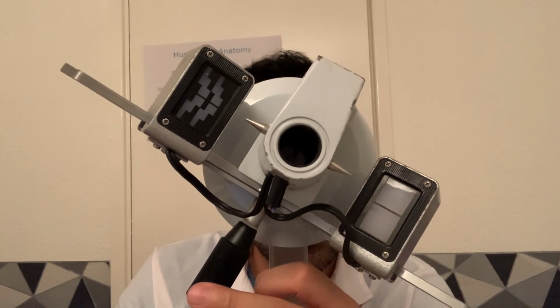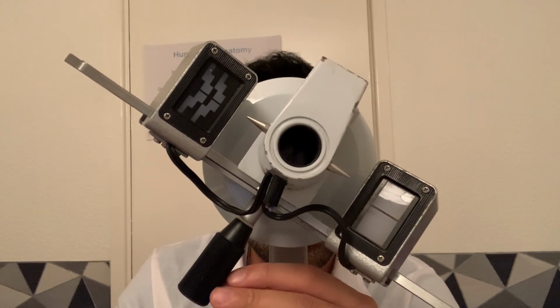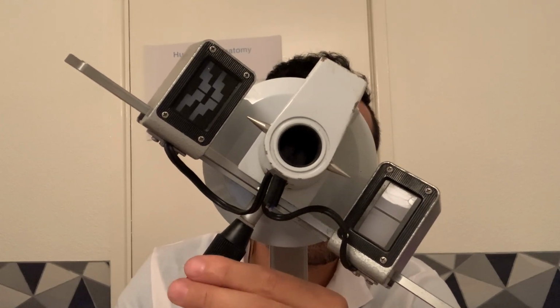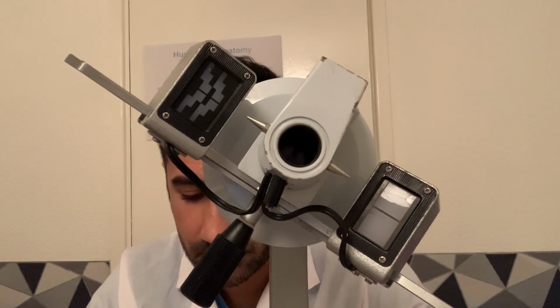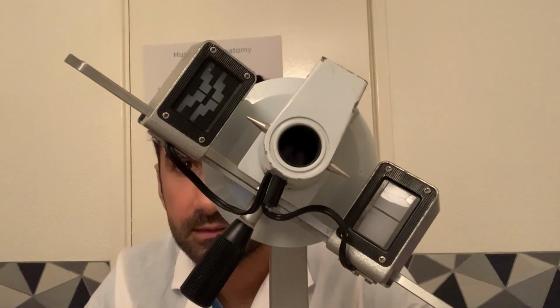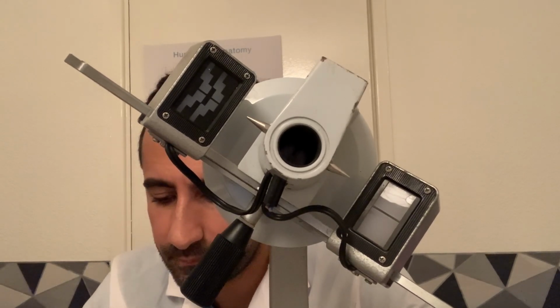And just have a slight discrepancy, so we're not exactly 90 degrees apart. It looks to be .7 millimeters at 35 degrees. Okay.